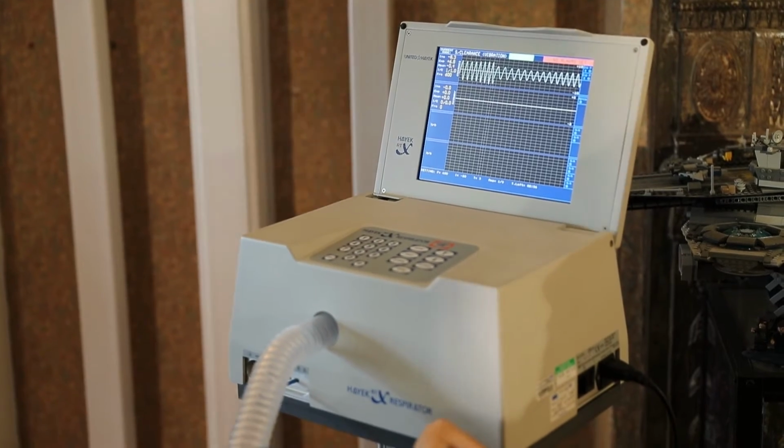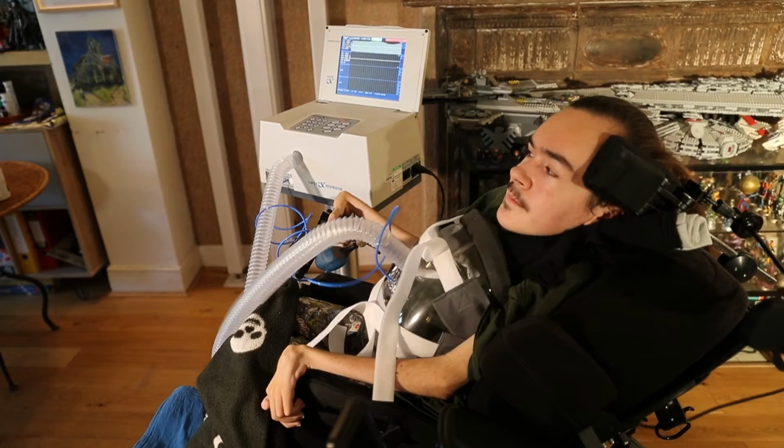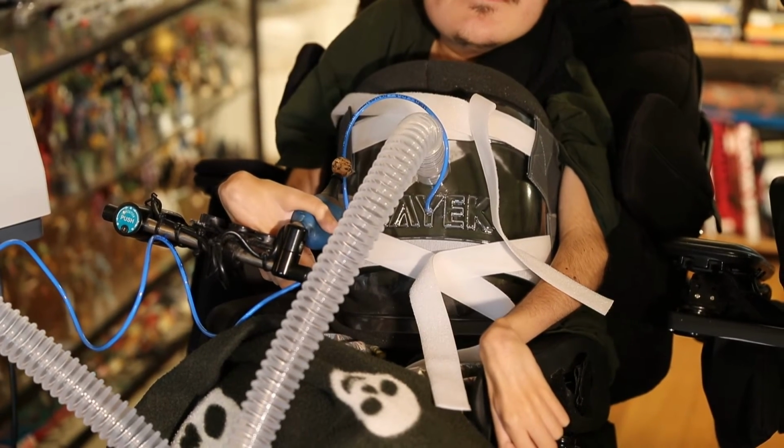When I'm not ill, I use the machine every morning on secretion clearance and cough assist modes as soon as I get up. It frees you up to communicate and also just to get sips of water constantly in, because hydration's a big thing. Throughout the day he is offered fluids every hour or so, even when he's well. Whereas on the BiPAP or obviously more invasive ventilation, that wouldn't be an option.